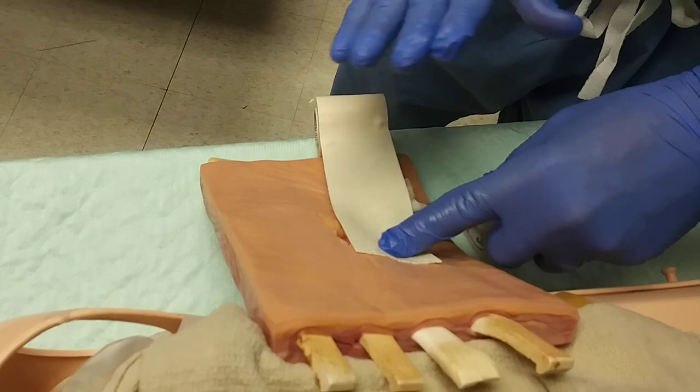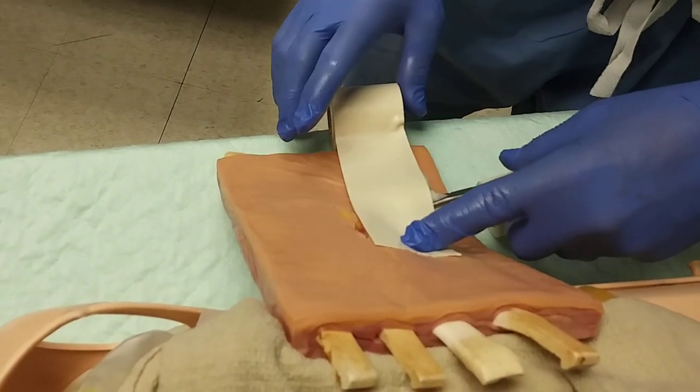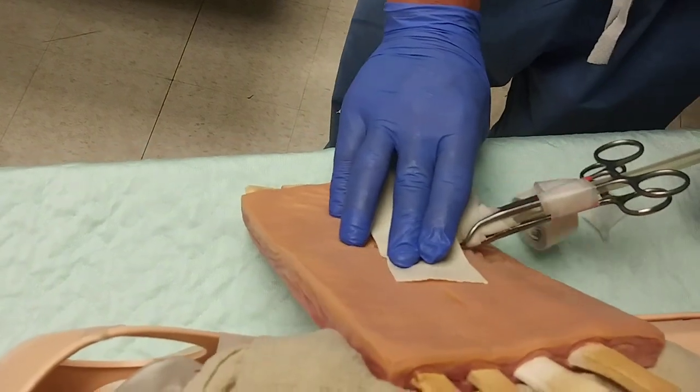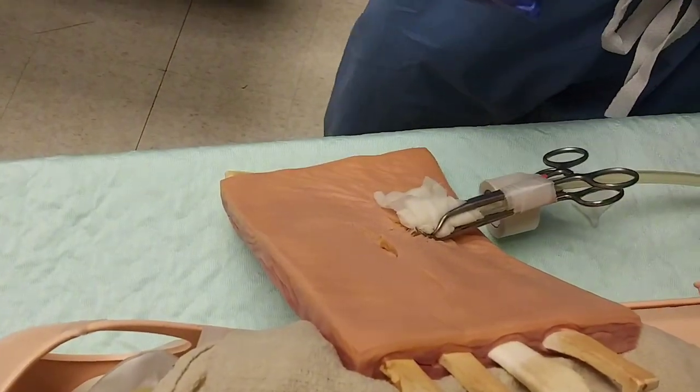We then start placing our foam tape and/or an expired AED pad that can be used to secure and keep that down, and you're going to have a nicely secured chest tube at that point that can be replaced in the trauma bay. If you're done with it, you're good — you'll have a comfortable take-out at that point.